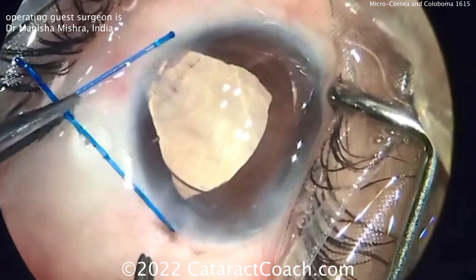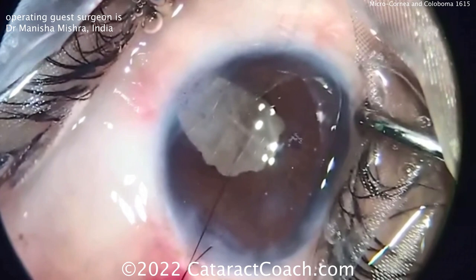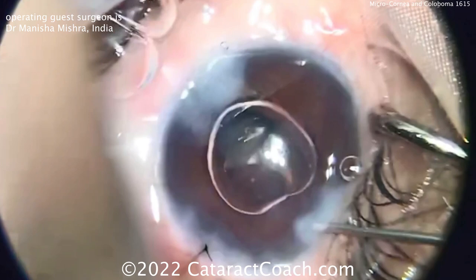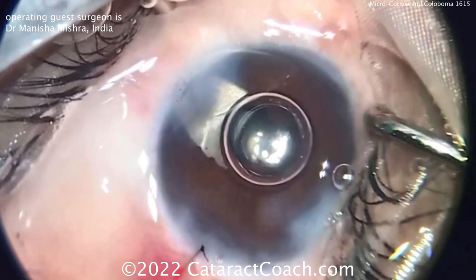The iris comes back into the eye and that looks like a very nice result. Time to seal up the incisions. Again there's that coloboma area — I may put a little triamcinolone in the anterior chamber right now just to make sure there's no prolapse of vitreous through that gap of the coloboma. There's probably loss of zonular support there and there can be an opening. Hydrating the incisions — looks like a beautiful case. Thank you Dr. Mishra for sending in this video; you did a great surgery for your patient.